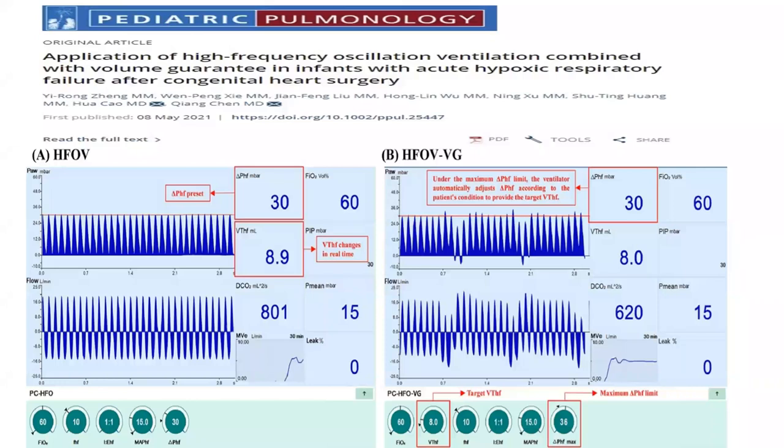Thank you so much. If you don't mind, Dr. Abdullah, I'd also like every one of our senior colleagues and everyone to answer this question while we are chatting. Does the availability of the ECMO machine and the surgeon around us in cardiac ICU minimize the use of high frequency ventilation? Like when I'm at risk of struggling with hypoxemia, you know what, just get the ECMO machine. I can get it very quickly. The surgeons want a good outcome. Does it actually affect us as intensivists in utilizing our resources for high frequency?